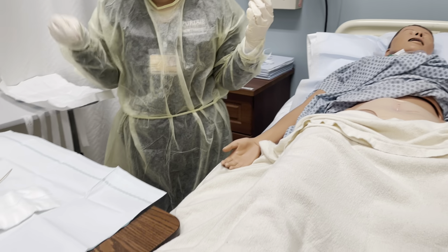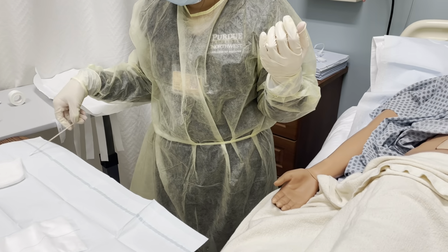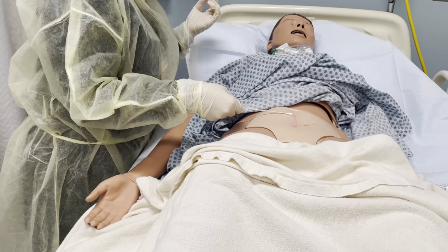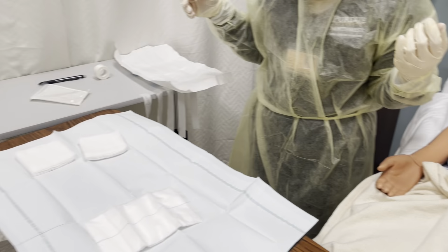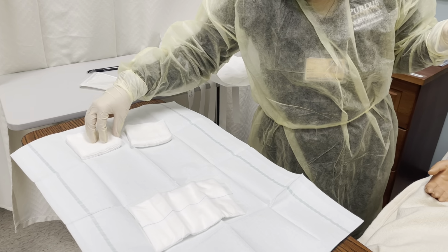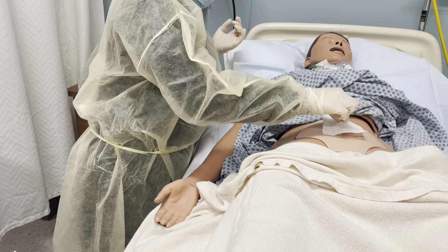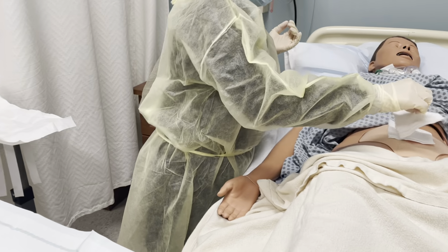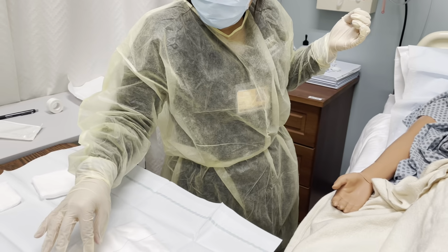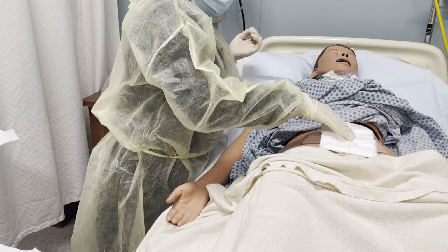Okay, dropping it into my trash can. Get the other Q-tip, dip it in my ointment. Doing the other half. Okay, dropping it in the trash can. Now I'm going to take one, drop it onto my wound, and I'm going to take another one, dropping it onto my wound, take my abdominal pad, place this on top of my wound.